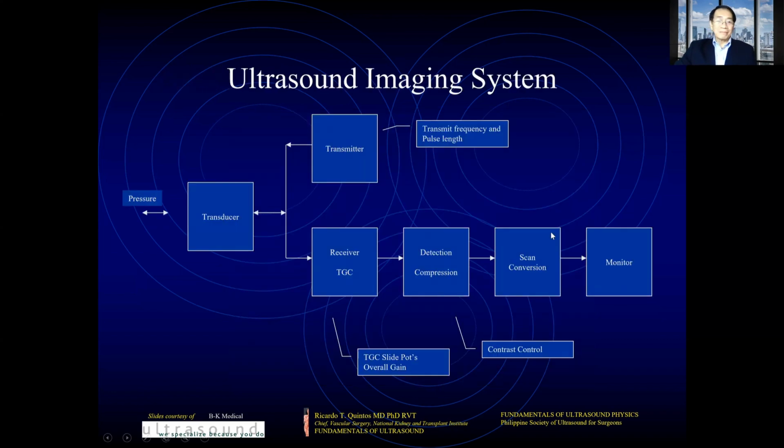Okay, to summarize, for the fundamentals of ultrasound and the fundamental physics, we talked about pressure, the physics of sound, how sound behaves, the characteristics of sound, the properties of sound, the properties of media that affect its acoustic characteristics. And then we talked about the transducer, which transmits and receives the sound. And we talked about the beam anatomy and the beam theory.